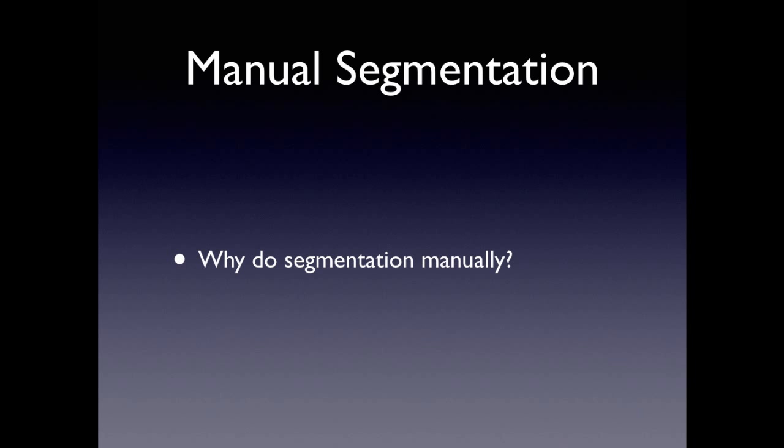You're never going to be able to outperform that. So, if you're using any kind of automatic method, it needs to be comparable to a human rater. And the other main use is when you have certain structures that are very detailed and intricate. It's really hard to get a good automatic segmentation. So, you're almost forced to go in by hand and do that. And this happens all the time if you have certain pathologies or injury or just really small and intricate structures. It has to be done manually.